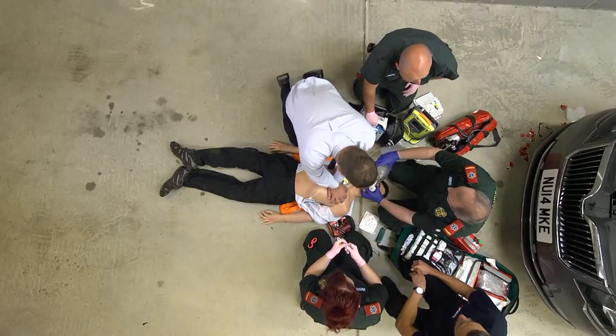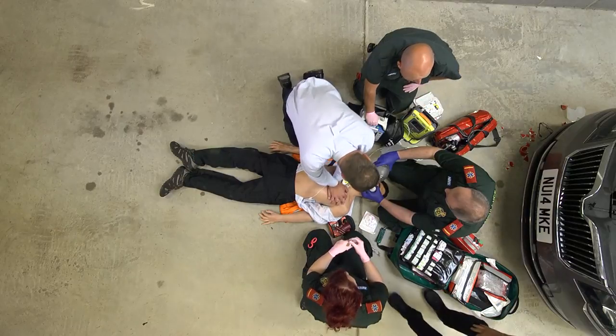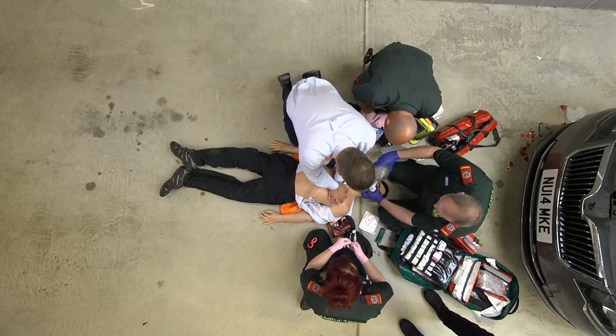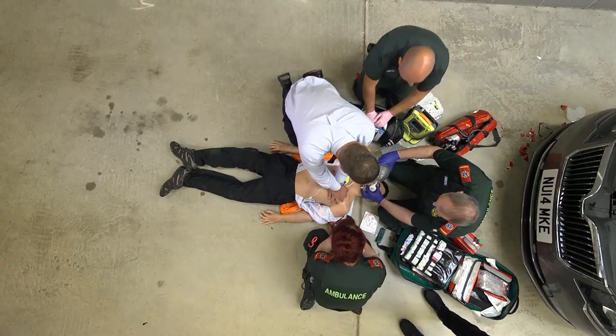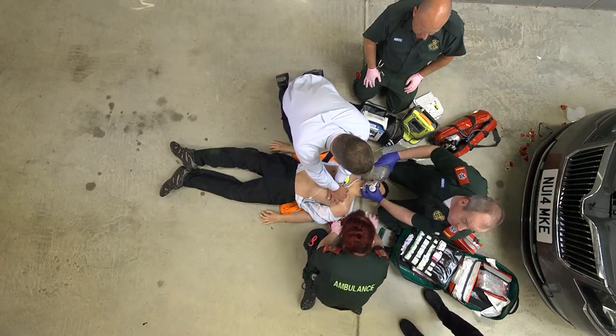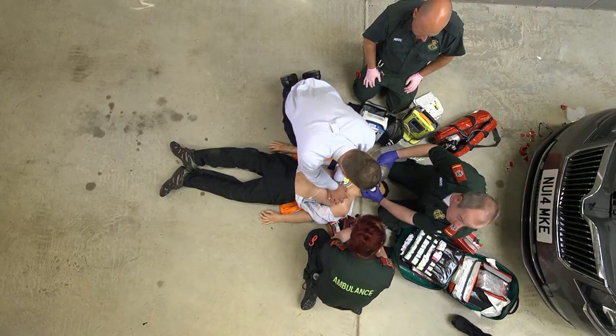Steve, the CPR shows VF still, just to update you. Excellent. Okay, well, we're not due for a rhythm check just yet. We'll get some access first and then reassess. 29, 30. Do you need anything from me? No, that's brilliant. Thank you, Nathan. That's excellent. You've done a really good job. All right. We'll look after him from here.